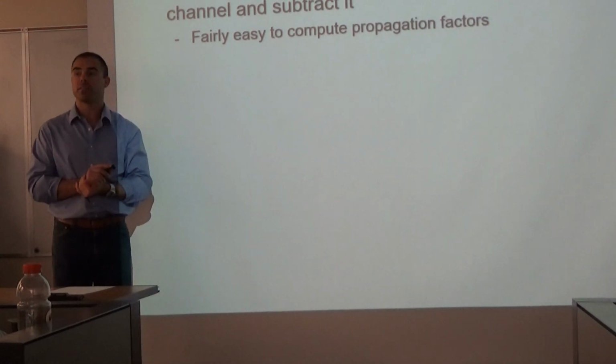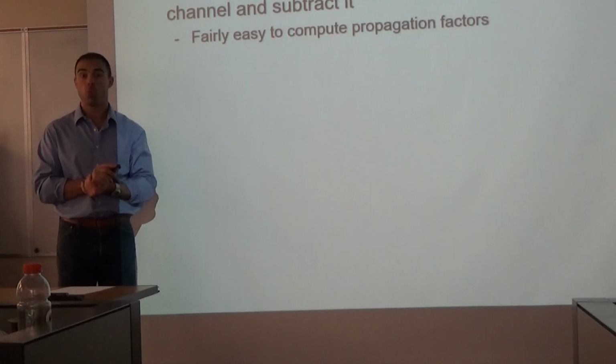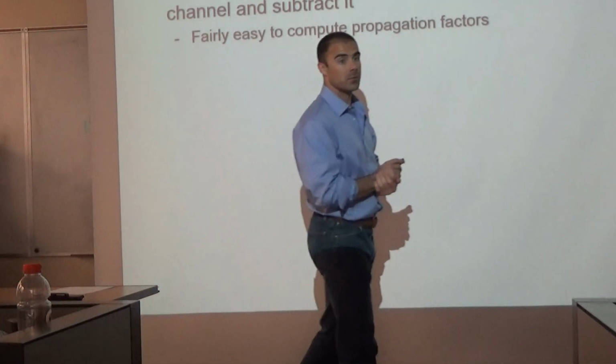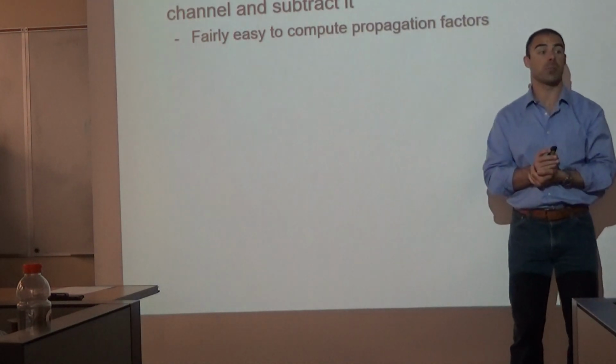And so the last thing that we'll touch upon in terms of artifacts like this is the idea that we can correct the artifacts too. So remember I mentioned independent components analysis? ICA. Okay, this is one way to correct the artifact and keep the data. Okay? So in this way, you keep both the baby and the bathwater. You just clean the bathwater.